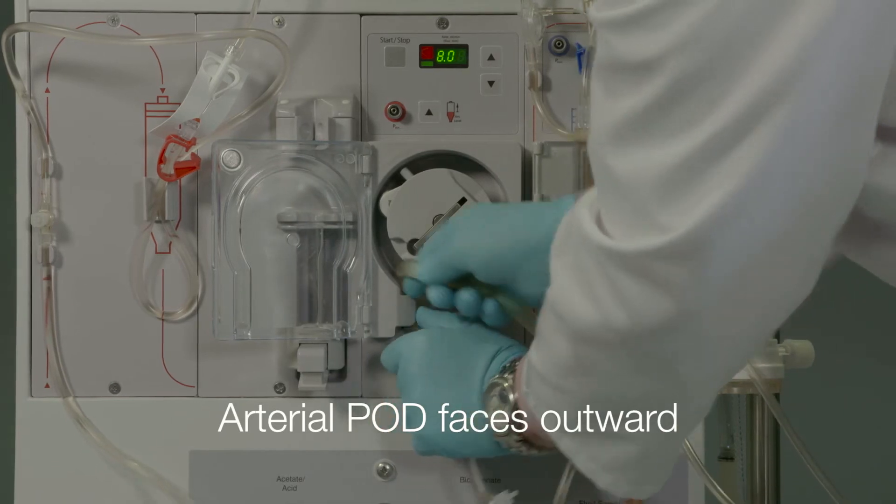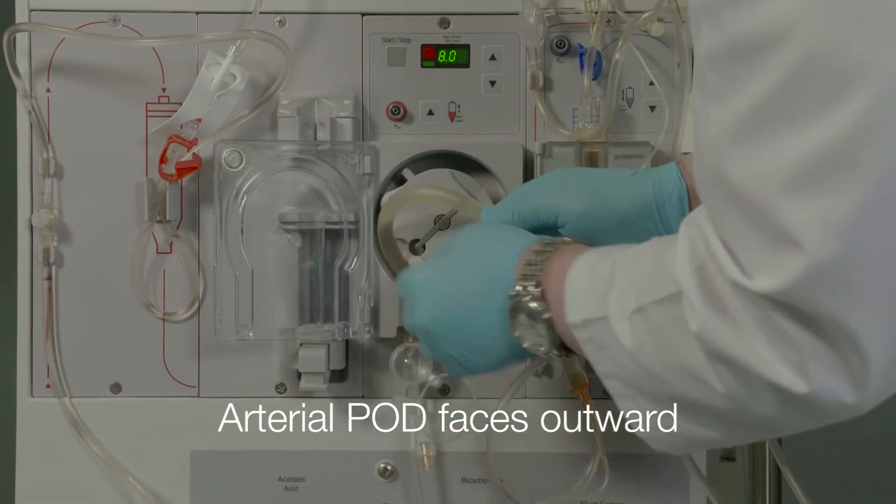Position the arterial pod dome facing outward and thread the pump segment into the blood pump.